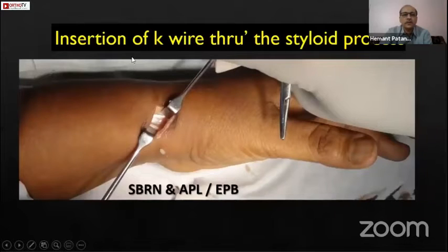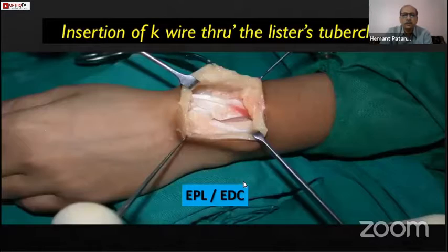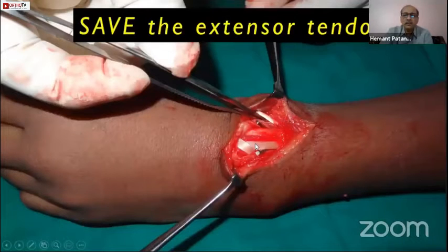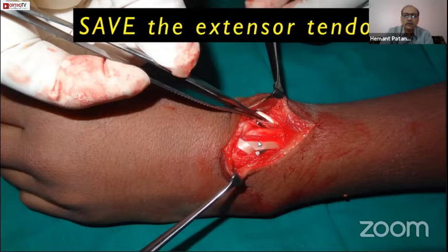When inserting a K-wire through the radial styloid, identify the superficial branch of the radial nerve, identify the two extensor tendons of the first compartment, isolate them, and then insert the K-wire — don't do it without that. When inserting a K-wire through the dorsum or from the lateral aspect, identify the EPL tendon or the common extensor tendons if doing the Kapandji technique, and only then put in the K-wire. Don't do it blindly. If tendons get impaled by the K-wire, there will be a big problem.